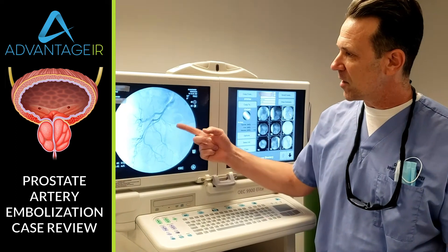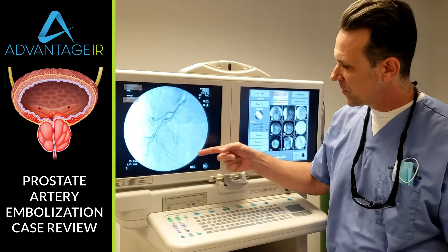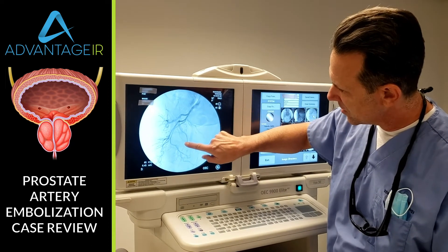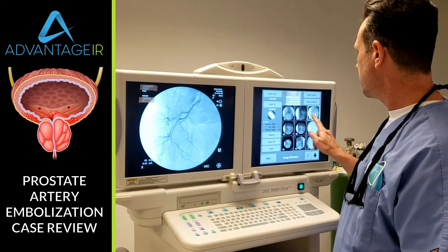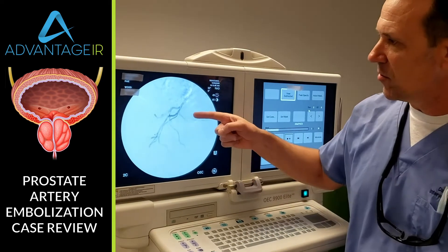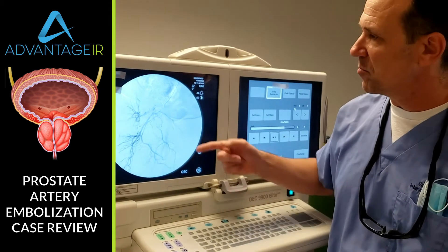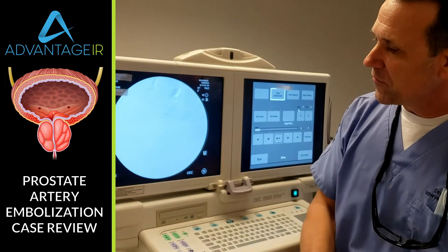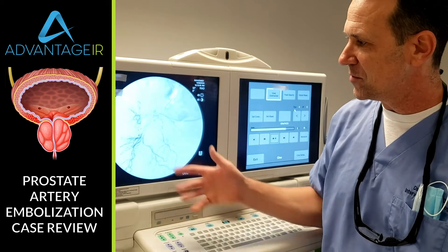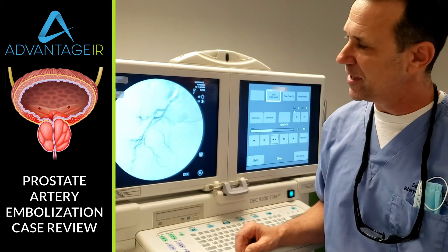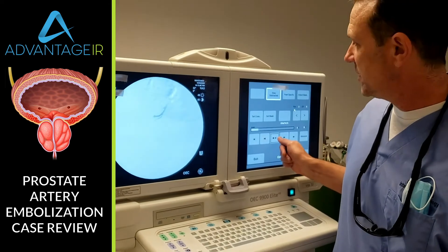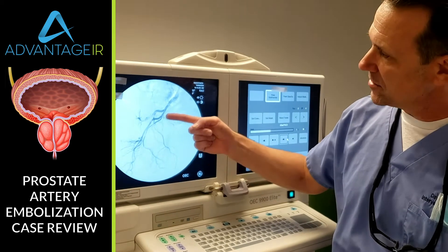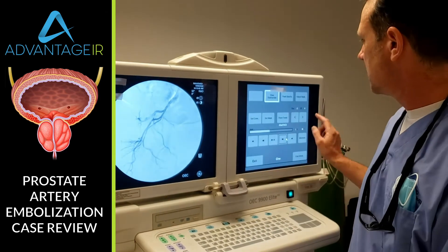Here we see the right iliac artery angiogram. The prostate artery is this little artery coming out of the internal pudendal and going along here — this is the right prostatic artery. It can be interesting to watch these angiograms run as they're being done. We're injecting contrast dye. You can see how the contrast flows through the arteries and perfuses through the tissue. It gets washed out by new blood coming in. So what we do is we freeze these and click through them to see that little prostate artery coming off there.